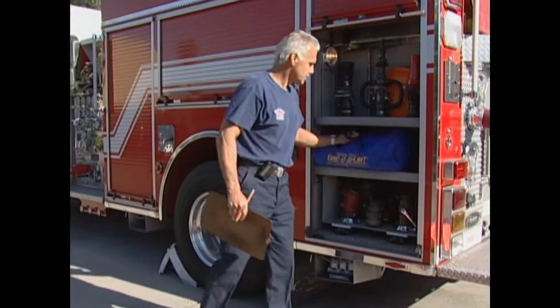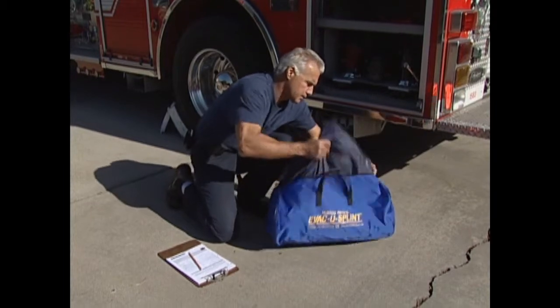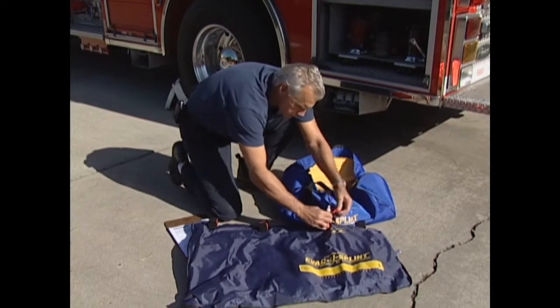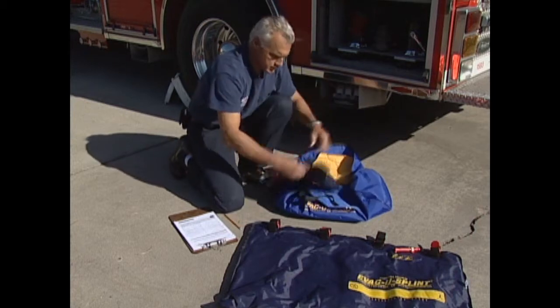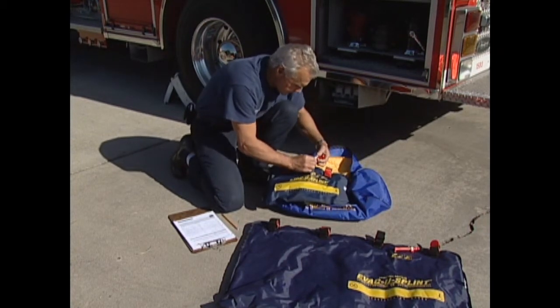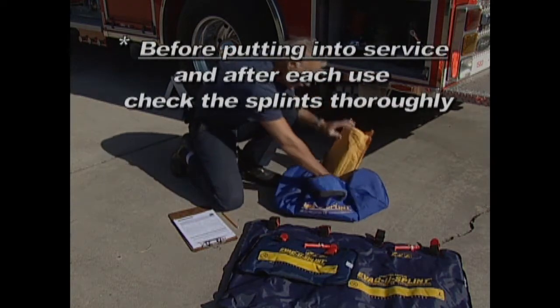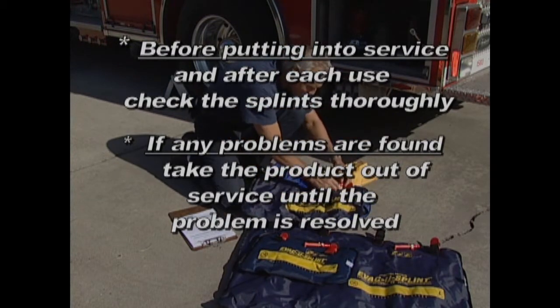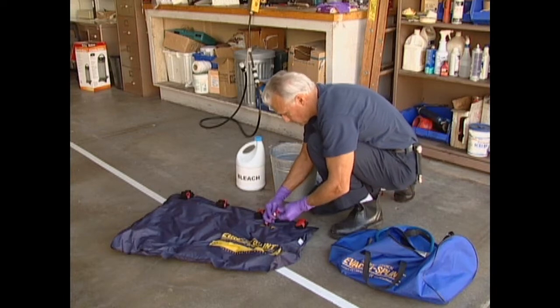To properly maintain your EVAC-U-SPLINT, establish a preventive maintenance program that meets the needs of your particular service area. Daily inspection should include looking for anything that could affect the integrity or performance of the EVAC-U-SPLINT, such as tears, broken parts, loose hose clamps, inoperable valves, etc. If damage is found or if maintenance is required, take the EVAC-U-SPLINT out of service until such time that it can be properly repaired or replaced. The EVAC-U-SPLINT is a durable splint that will last for many years when properly maintained.